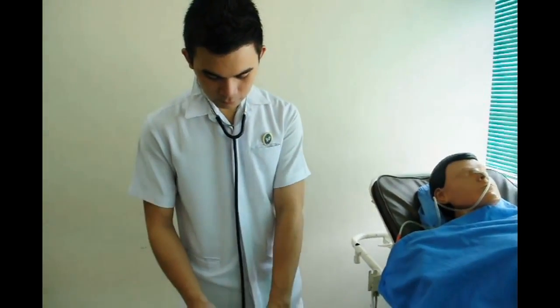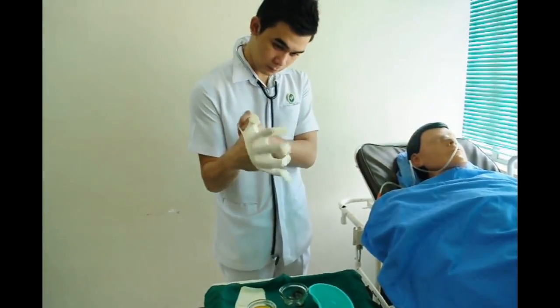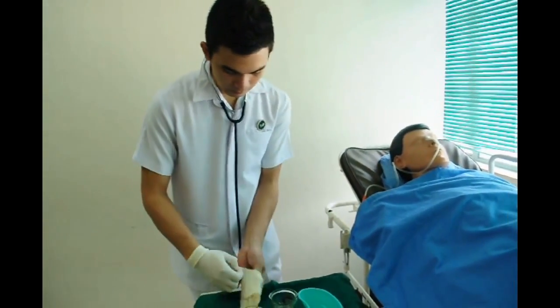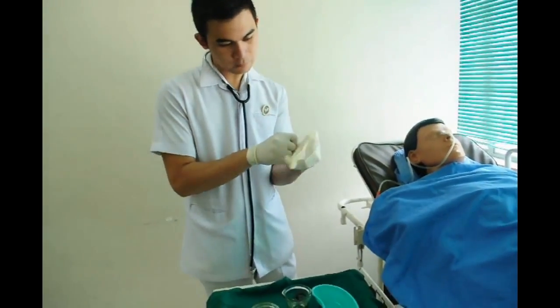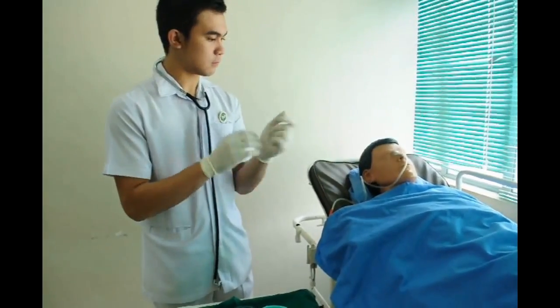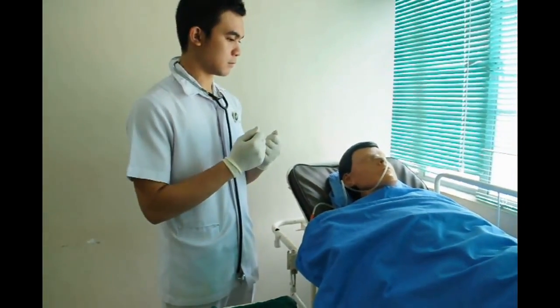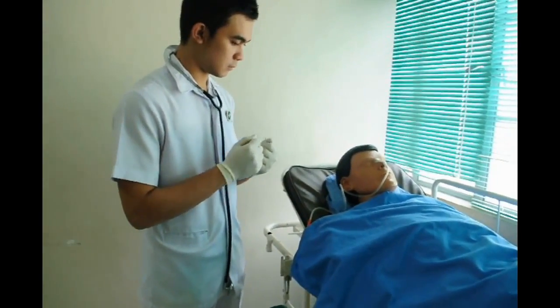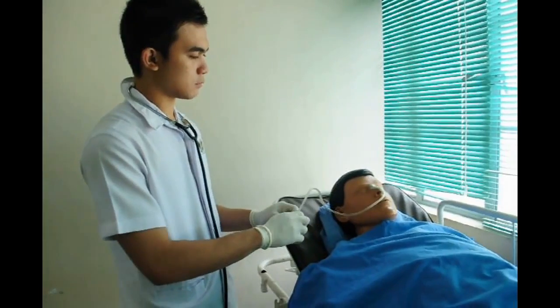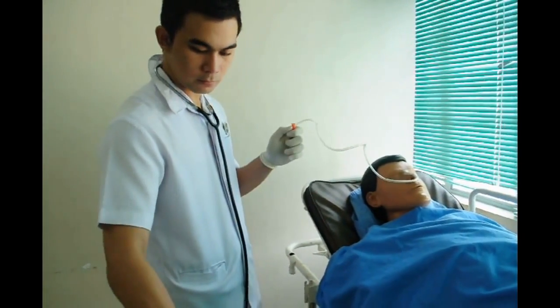After performing hand hygiene, Nurse Kelvin now performs clean gloving. This is to reduce the transmission risk of infection. Then, unpin the tube from the patient's gown. Check the nasogastric tube by first instilling 30 ml of air, then aspirate for gastric contents.